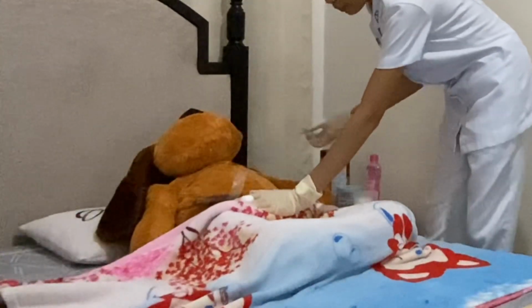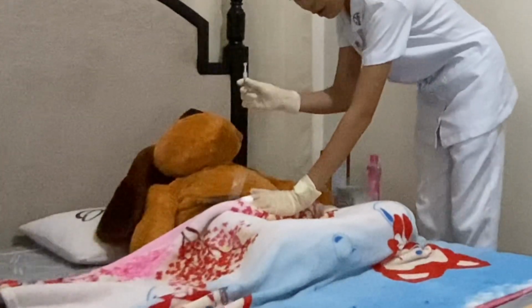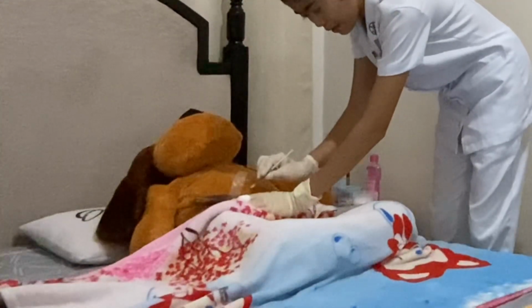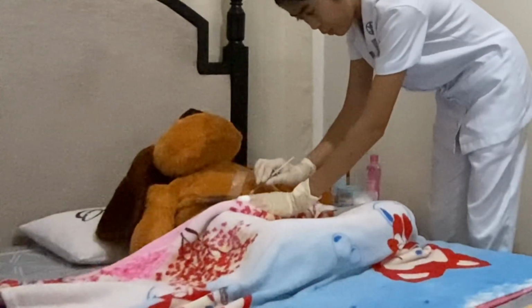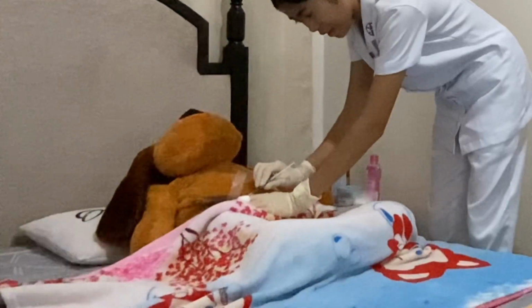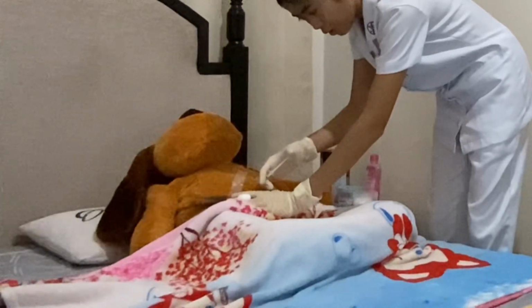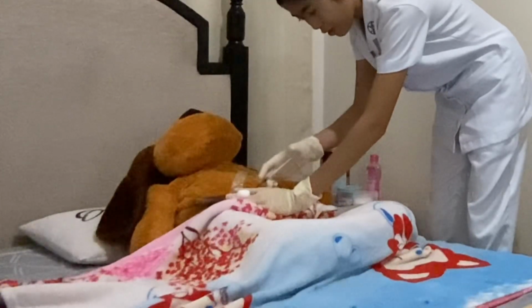And then we're going to hold it between the thumb and the forefinger, like this, and then slightly squeeze the injection site, and then you're going to insert the needle using a 45-degree angle like that.